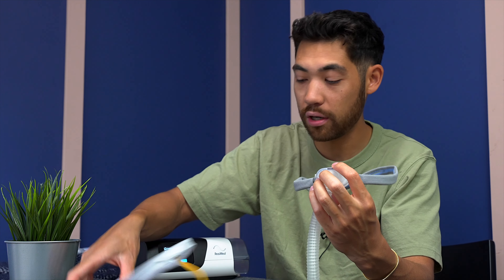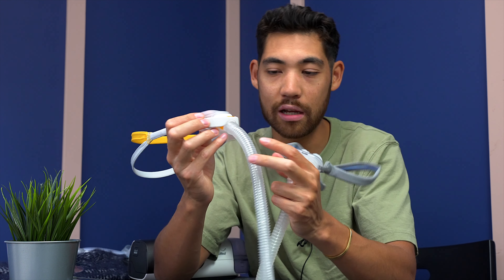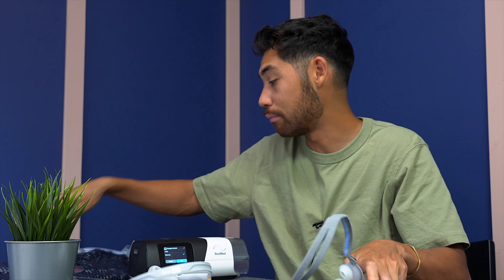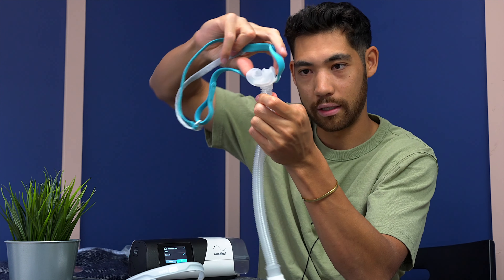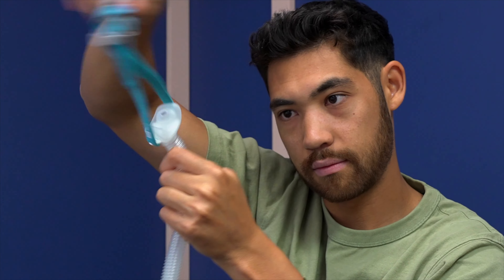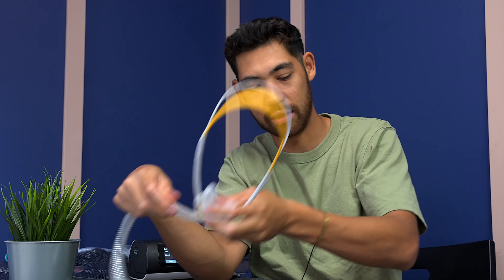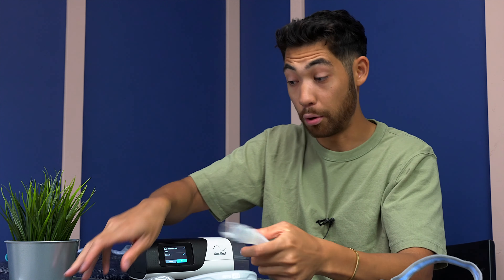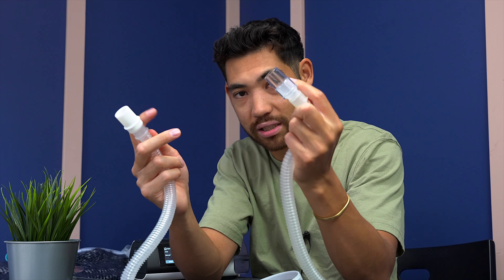In terms of the tube design, both tubes don't have a full 360-degree swivel — I like the AirMini because you can spin it 360. These guys, neither of them has a 360 spin, so both build a little bit of tension in the tube. However, both do have a little bit of swivel on the bottom.